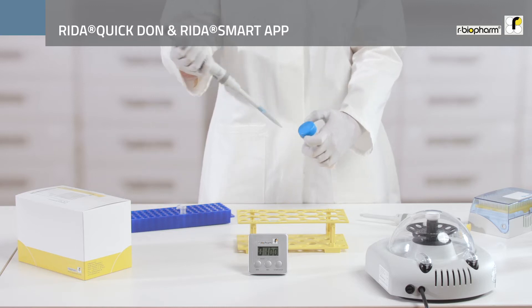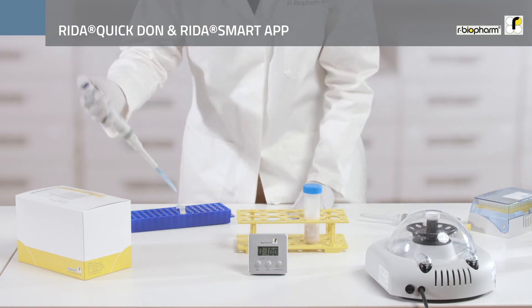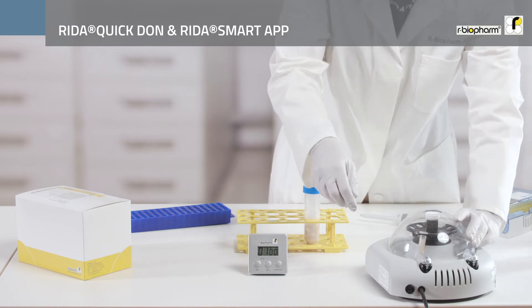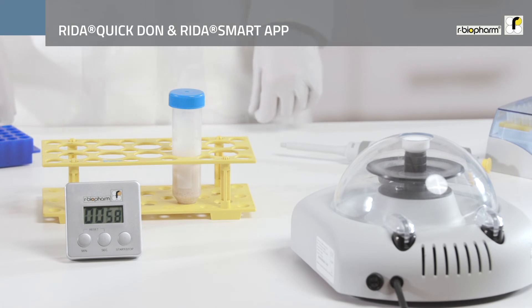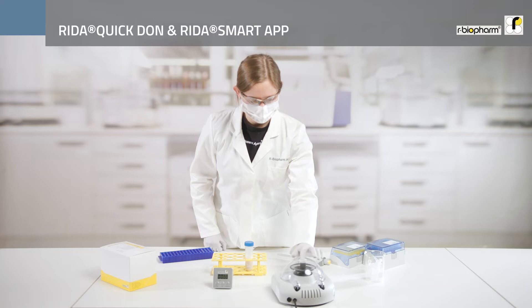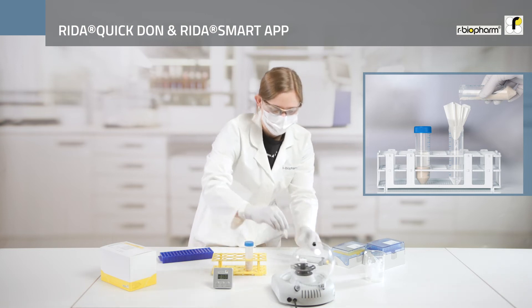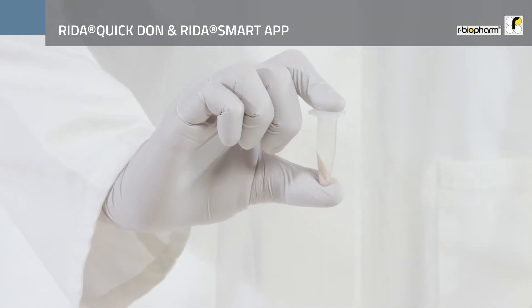In the next step, transfer a part of the sample into a suitable vessel, for example an Eppendorf tube, and centrifuge it at 2000 g for one minute. If you do not have a centrifuge at hand you can also filter or allow the sample to sediment. It is important that the solid and liquid phases separate from each other and that a particle-free supernatant is produced.